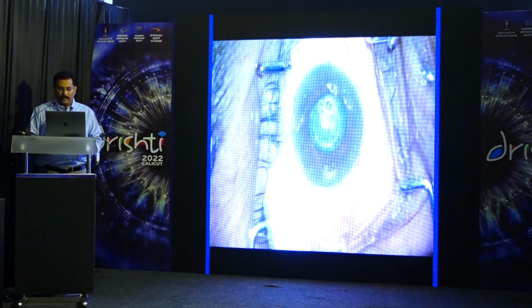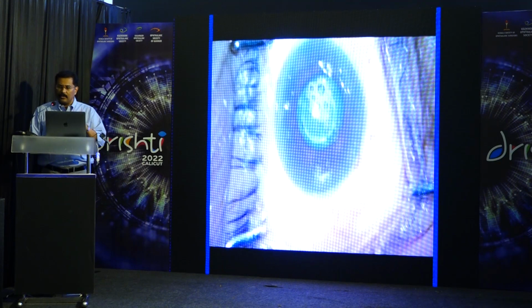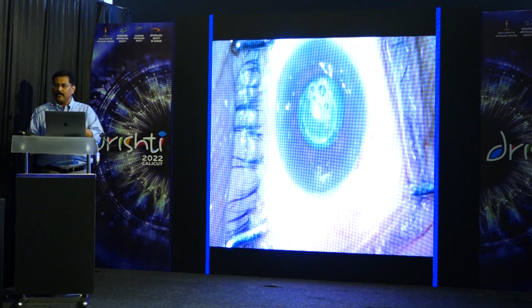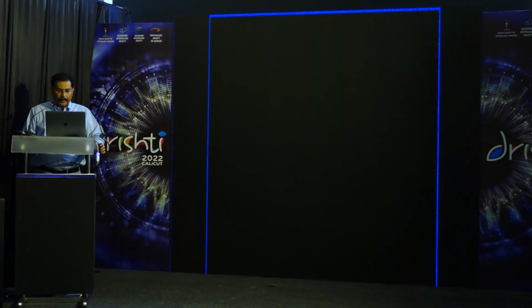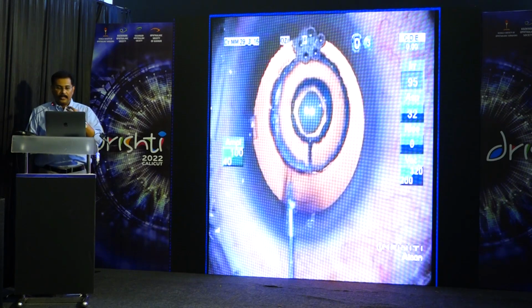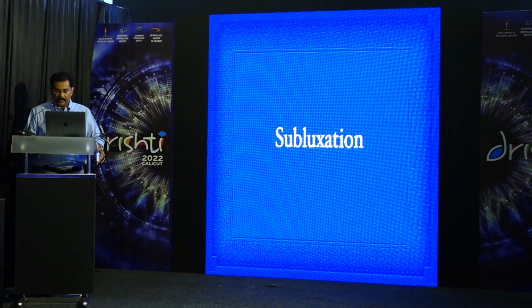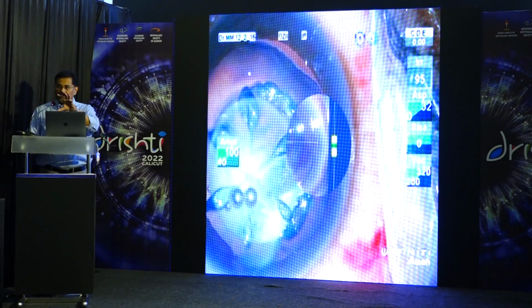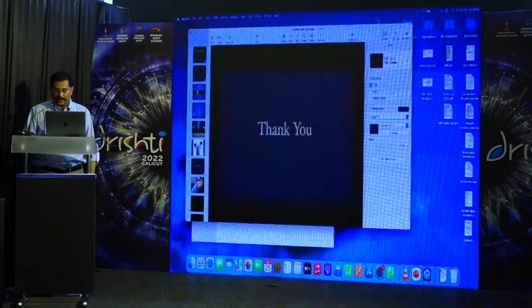So I don't want to go into small pupils. You cannot be doing, if it is smaller than 4, it's as simple as that. You cannot do a capsulorhexis through the iris. That is not possible. Maybe you can do the phaco, get the pupil larger, and then extend the rhexis margin. Posterior polar is the greatest advantage. You can create a femto delineation and take out the nucleus like what you see here without any rotation or any hydro procedure. And subluxation also, you can locate the rhexis away from your subluxated area, and having a rhexis is very, very important to place capsule stabilizing devices.